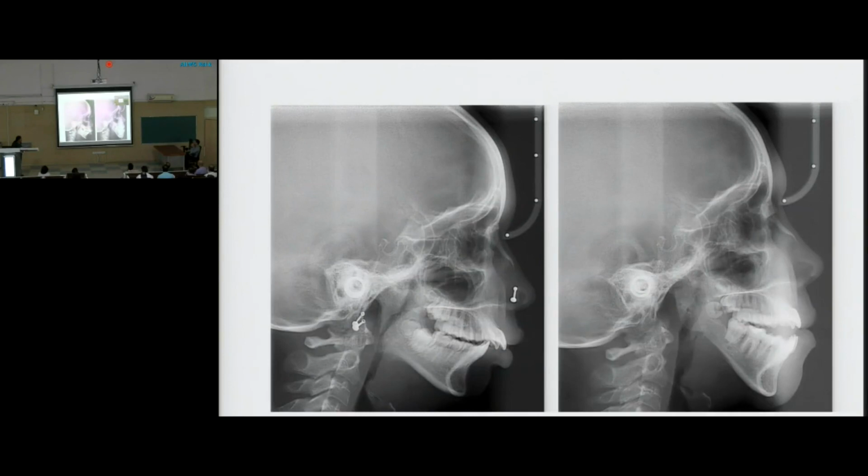If we could see, yes, the mandible which was retrognathic is now in position, and the pharyngeal airway space is also being addressed here. The upper and lower are better, and the mandible has moved forward. The TMJ ankylosis release has also been done.